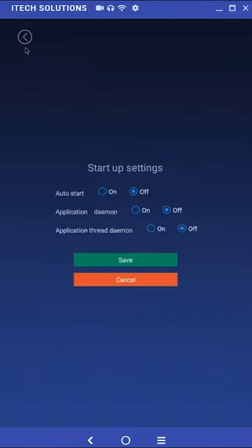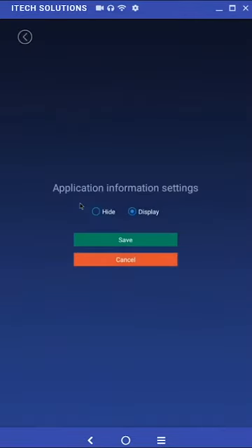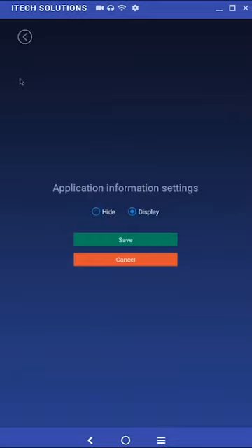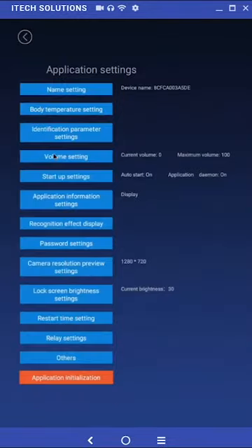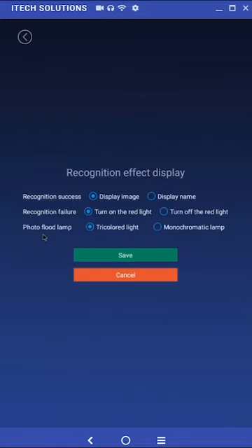In the application information settings menu is where we can choose to hide or show the blue information bar on the bottom of the main screen. Setting this to hide will no longer display the information bar. Inside the recognition effect display menu there are three options: recognition success, recognition failure, and photo flood lamp. Changing recognition success to display name will no longer show the registered user their picture upon check-in.